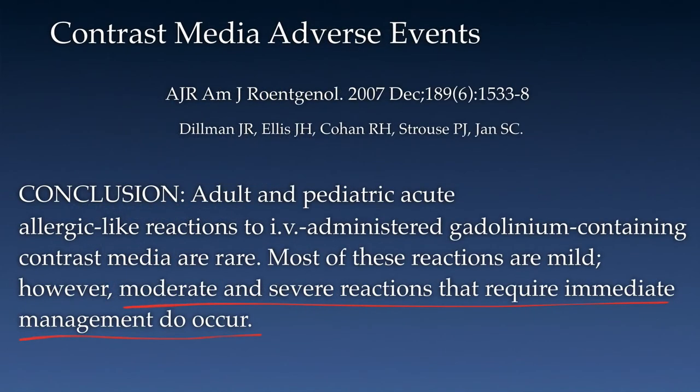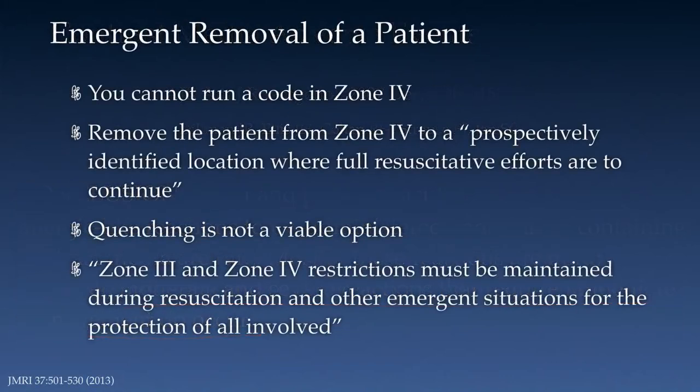We sometimes forget the fact that a gadolinium-based contrast agent is a drug, and when you inject anything into a patient, an adverse event can occur. In this paper, the authors state that moderate and severe reactions that require immediate management do occur. We should all know that you simply cannot run a code in the scan room in Zone 4. Policies and procedures must be in place to address removing a patient from Zone 4 to a prospectively identified location where full resuscitative efforts can occur.